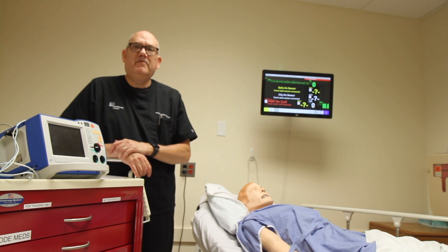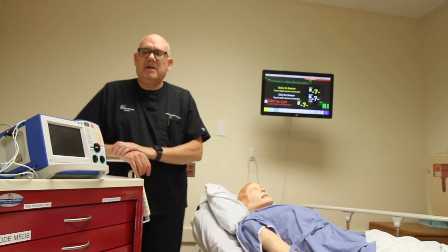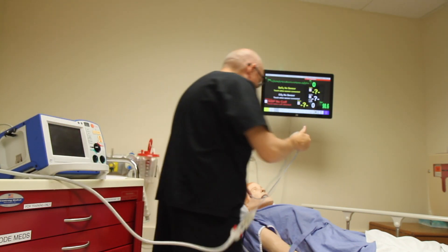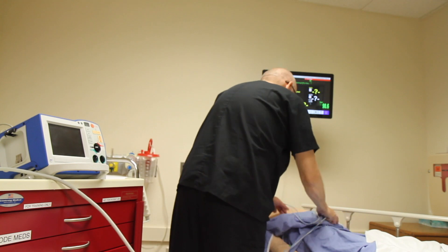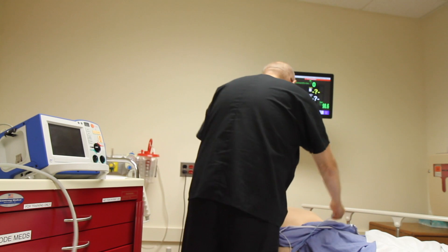In this module, we will review how to perform defibrillation. The process begins by attaching the hands-free pads and cables. I will expose the patient's chest, and following the diagram on the pads or the connectors, I will attach them to the patient.